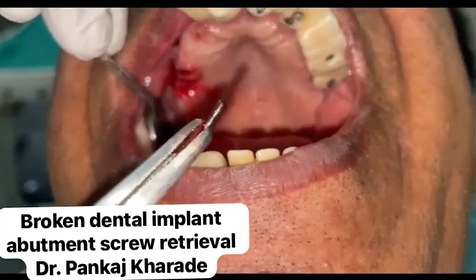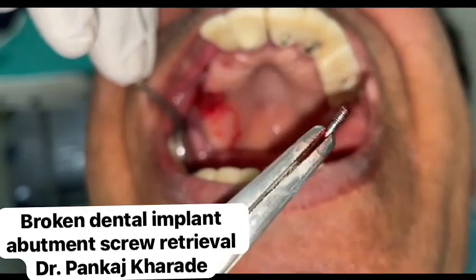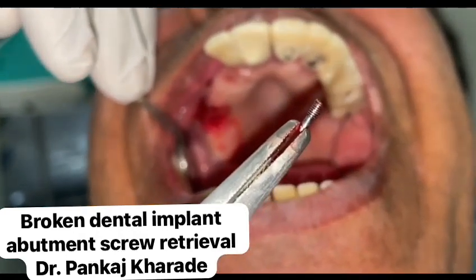Apart from that, a screw retrieval kit can also be used. There are many different types of screw as well as implant retrieval and rescue kits made by different companies. Noble Biocare, Neobiotech, Austem, BTI Biotechnology Institute, and Salvin Dental Specialties all make these types of kits.